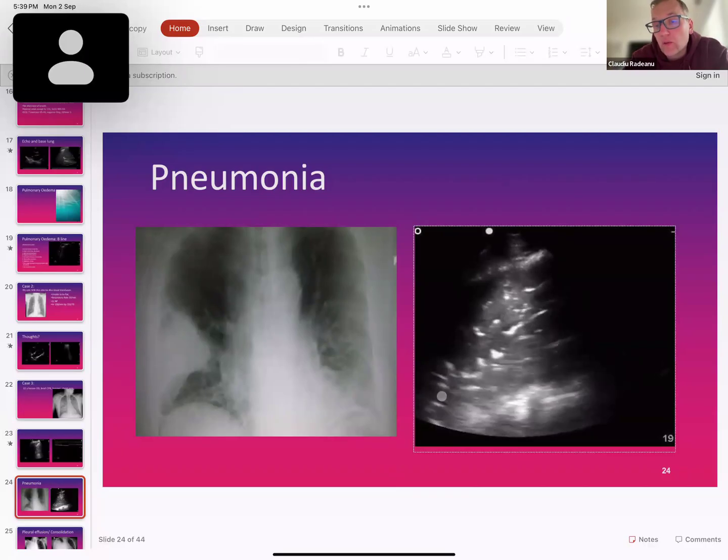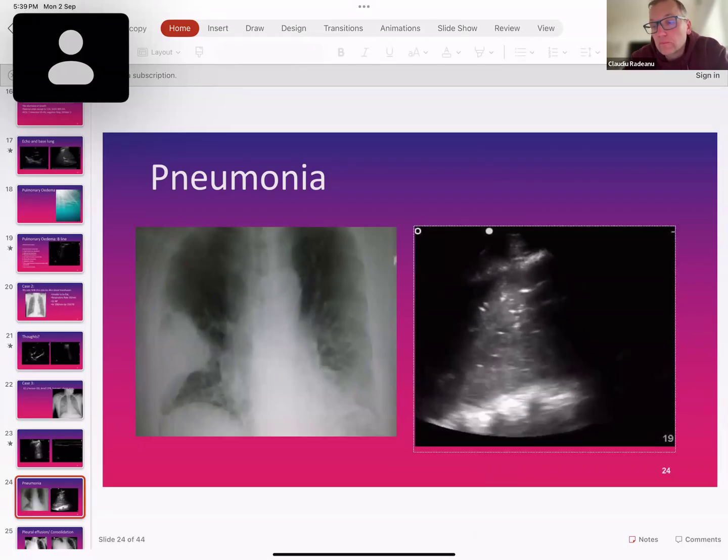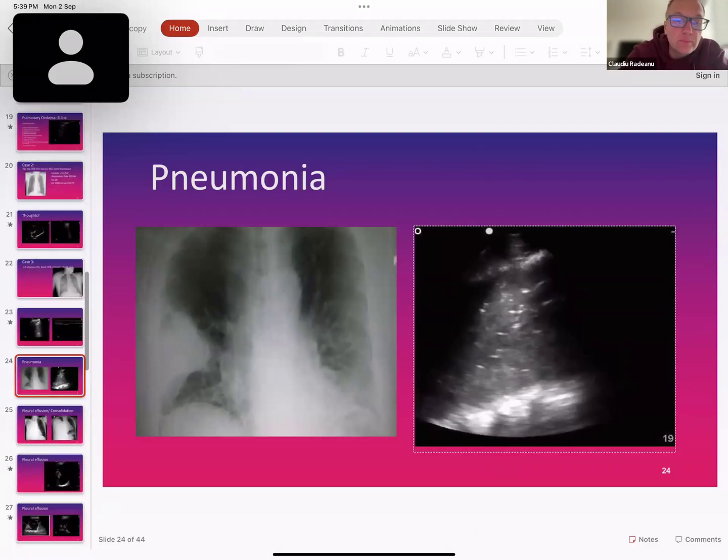When you take an inhalation, air comes into the bronchioli, doesn't reach the alveoli. It's just in the bronchioli, and it comes out as an increased hyperechoic. I hope that helps you with the next pneumonia patient.